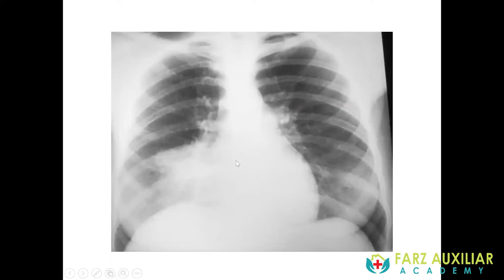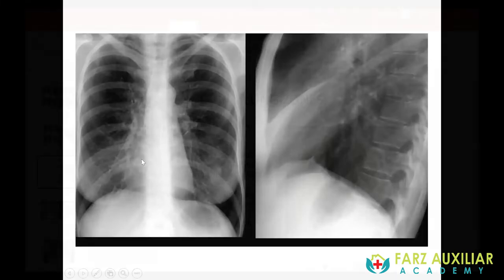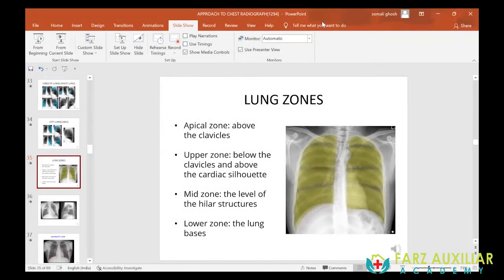As you can see here, we cannot see the right heart border, which should have been visible over here. That is because there is a consolidation in the middle lobe — the consolidation has silhouetted the right heart border. This is an example of a silhouette sign.